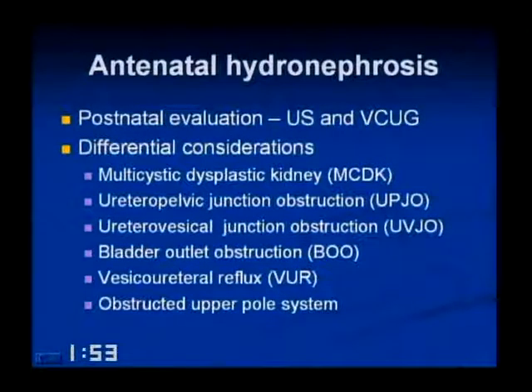Depending on what you believe, you could do the ultrasound right on day one of life. If you see something abnormal, then you can continue with your workup. If you do an ultrasound on day 1, 2, or 3 of life, you may not see an abnormality. The newborn is quite dehydrated and urine production is lower.